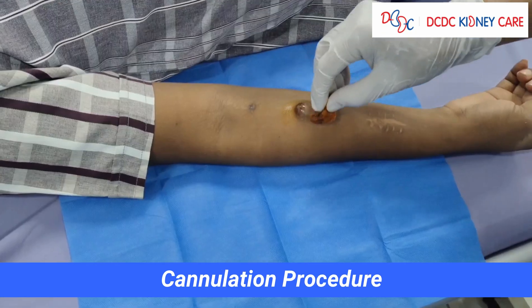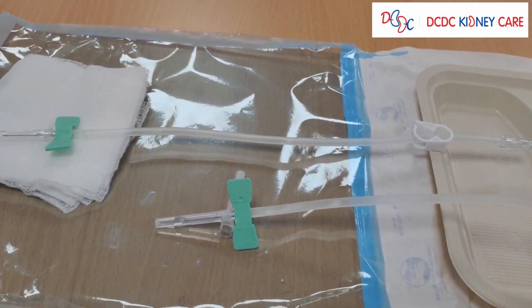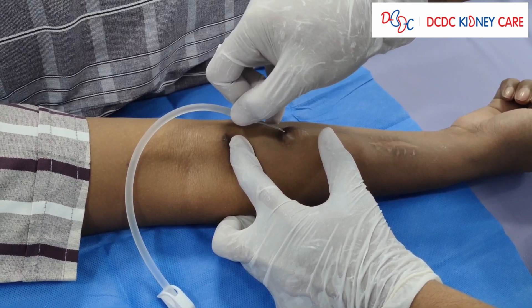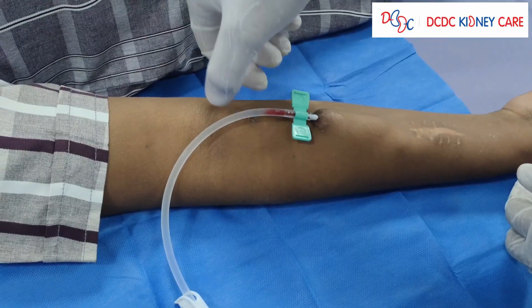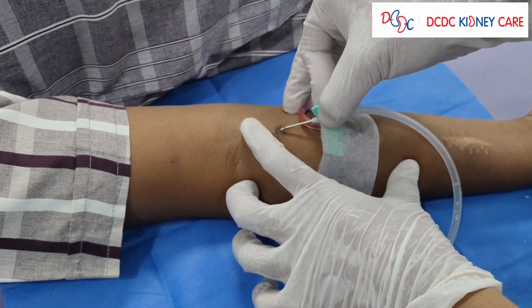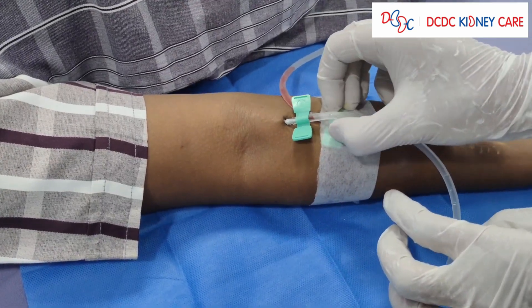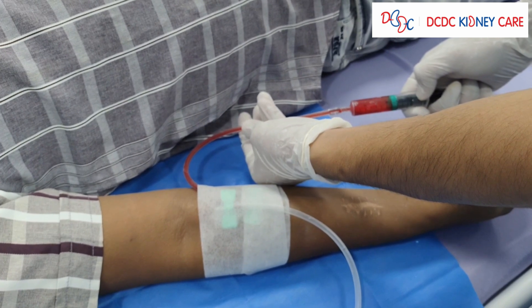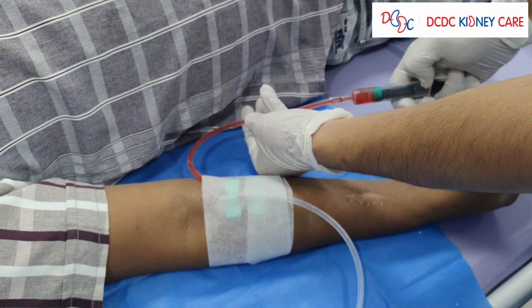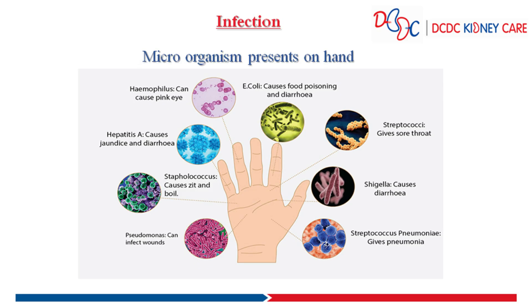Coming to the cannulation procedure: apply a tourniquet to the access arm and disinfect the access site as per unit protocol. Attach a 10 ml syringe filled with normal saline to prime the needle and remove air. Carefully cannulate the fistula using a 25-degree insertion angle. When blood flashback is observed, flatten the needle angle parallel to the skin and advance it slowly into the fistula lumen. Remove the tourniquet and tape the needle securely. Aspirate 1 to 5 ml of blood, then flush with normal saline and clamp. The syringe must aspirate and flush with ease. Monitor for signs and symptoms of infiltration — patients typically experience immediate sharp pain upon infiltration. Repeat steps for the second needle placement. Always follow hand hygiene before cannulating the AV fistula.